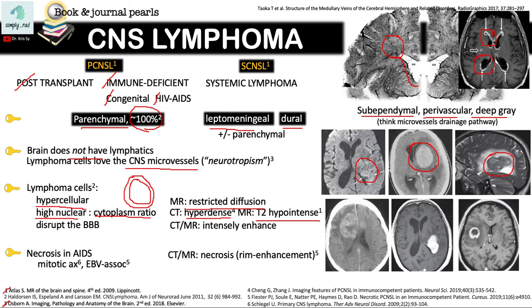Lymphoma also has the capacity to disrupt the blood-brain barrier. Because of this disruption, the contrast is now able to enter the brain and produce enhancement on CT and MRI. Here, we have enhancing masses in the periventricular region.